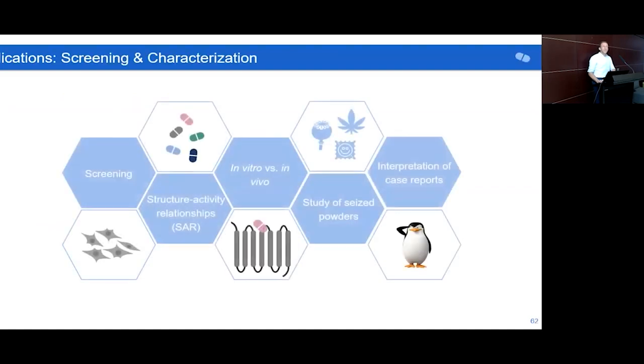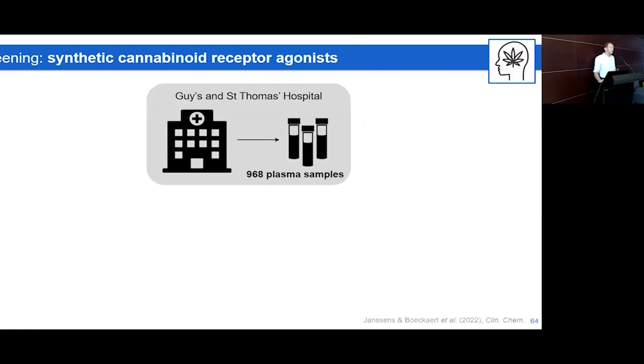Some applications. First of all, screening, because that's how the idea initially started. Rather than looking analytically at what's present in a biological sample, can we do this via an activity-based assay? To make a long story short, yes.